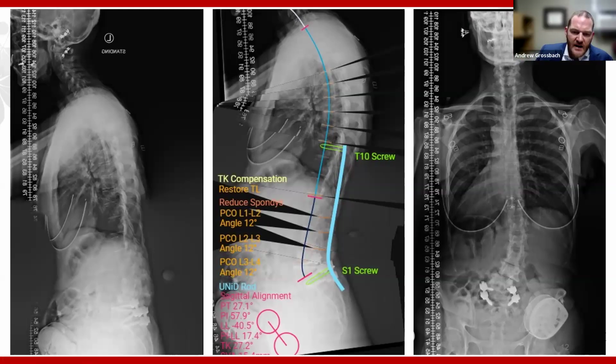And so sometimes the software can be helpful to know when that patient does not remove that thoracic kyphosis anymore, when they relax that thoracic spine and their kyphosis comes back, what's that going to do to the SVA? What's that going to do to the global alignment? And so here, the software is anticipating what's going to happen when they relax that thoracic spine and get that normal thoracic kyphosis back, what things are going to look like. Because if you don't judge that well, you could either undercorrect or overcorrect somebody, and globally they'll be off.